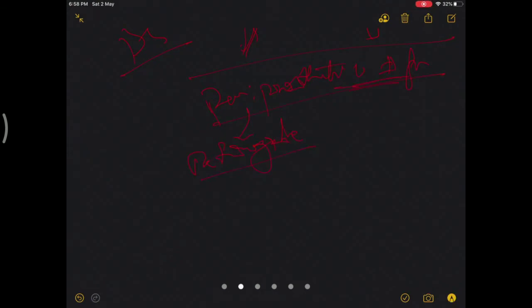For now, if the implant is stable and you have a supracondylar femur fracture, one way is to do a retrograde nailing, which is allowed in CR with ease because you don't have a box to accommodate the cam post mechanism.